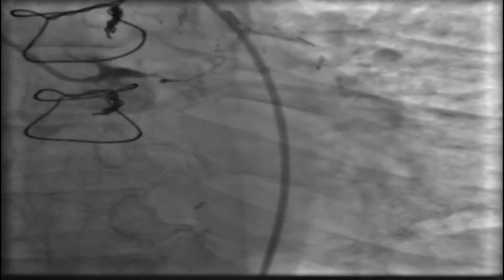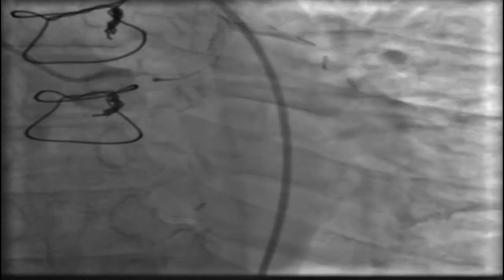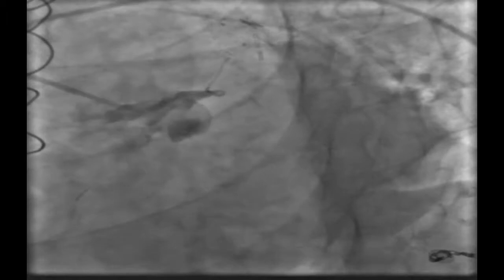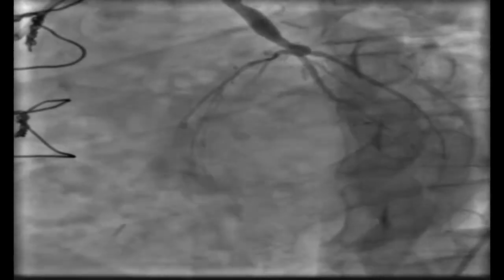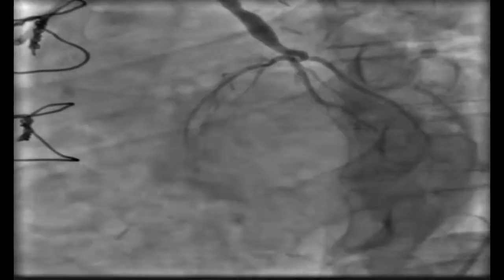His coronary angiography showed total occlusion of the distal left main with no filling of the LAD or LCX. We confirmed this shocking anatomy from the spider view. The first saphenous graft we found was a well-working one, filling the diagonals adequately.